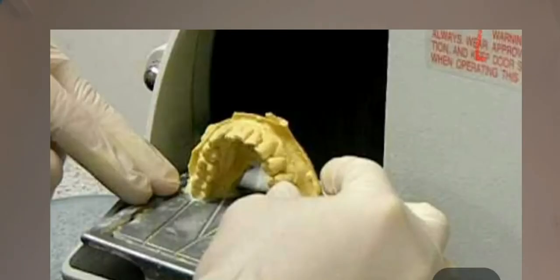Okay, we're almost at the end. Then we have trimming and finishing of diagnostic casts. These would be your models for orthodontic cases. This will establish an occlusal relationship between the mandibular and maxillary arches of the patient, and they form part of the permanent record of the patient. So it is very important that they look presentable, because it is a reflection not only on you but on the practice as a whole, in how you conduct yourself, present your work to the patient, and present and keep your records.